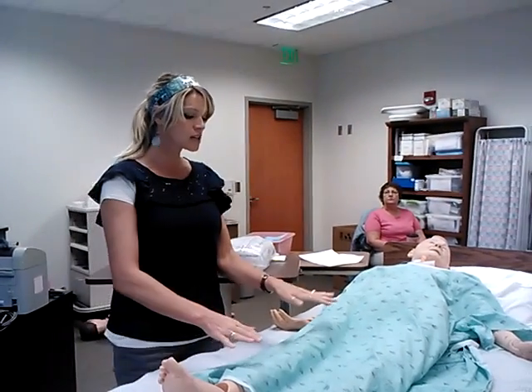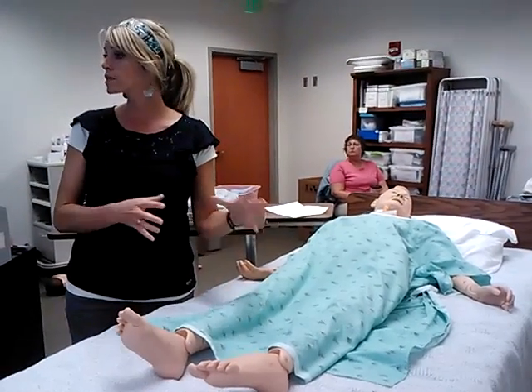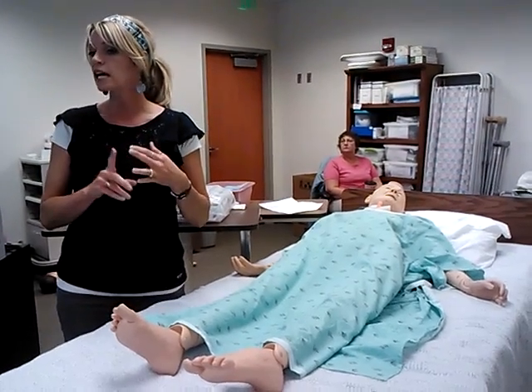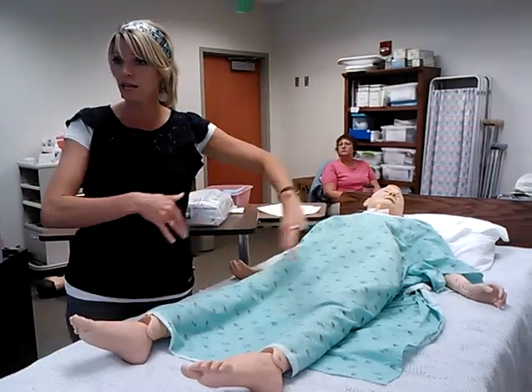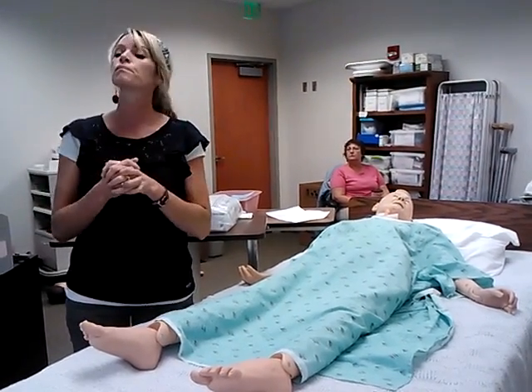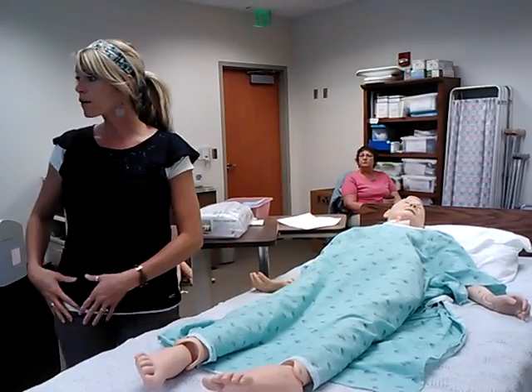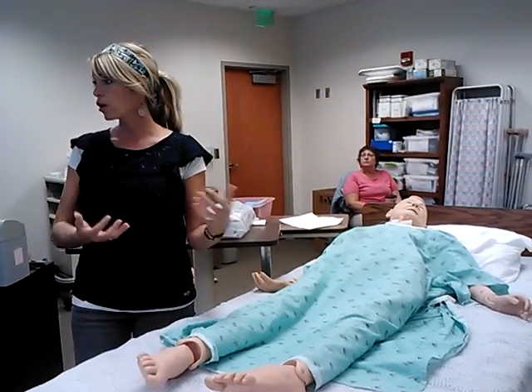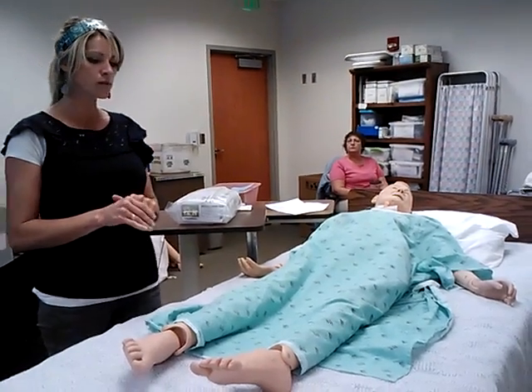Then you need to assess if they need help. Meaning, if they're a small child and you will not be able to maintain sterility trying to hold them, you're going to need help. If you have a large patient that you can't keep the legs lifted up on, or you can't get in there, you're going to need help with somebody with sterile gloves. If they have a fractured hip, you will not be able to hold that hip and move it as you would with a normal patient. You're going to need help holding the different areas, okay? So those are things that you're going to need to assess before.